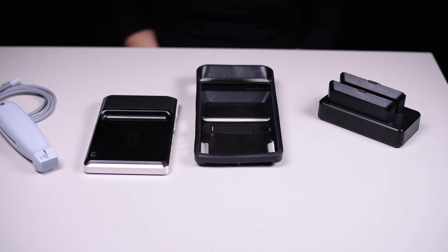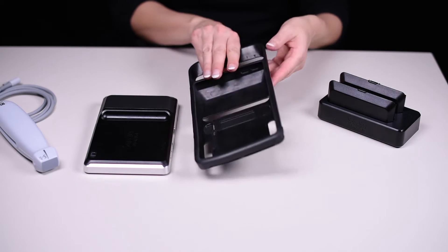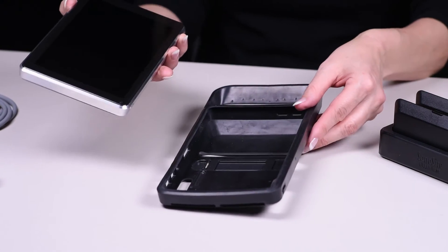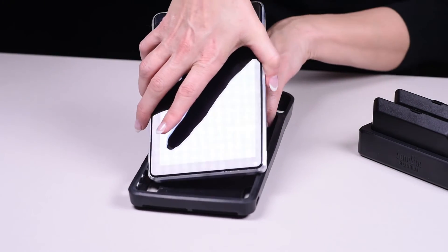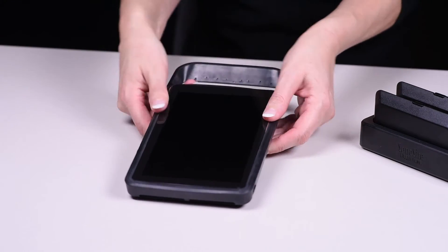The protective case does two things. It helps protect the system from breaking if it is dropped, and it also makes it easier to hold in one hand. Put the system in the case by inserting the system into the end and then bringing the opposite case ends over the system to hold it in place.